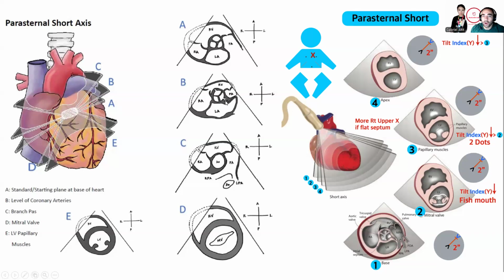You can see coronary artery, so the left and the right coronary artery. You can still sometimes see a bit of the pulmonary artery with the pulmonary valve, but you start seeing your tricuspid valve, your right atrium and left atrium. Not the greatest view to see the interatrial septum because we're often parallel to its course. So the best views are typically the subcostal views.